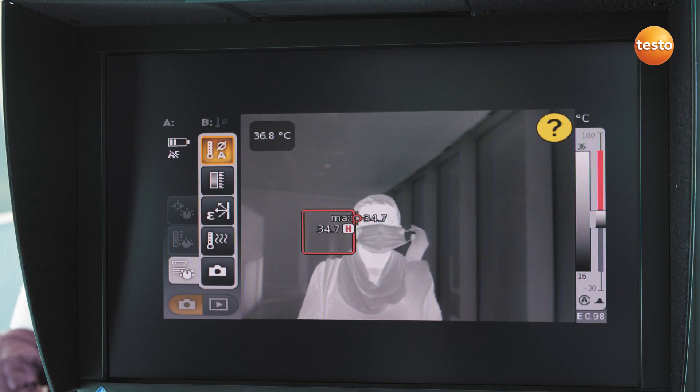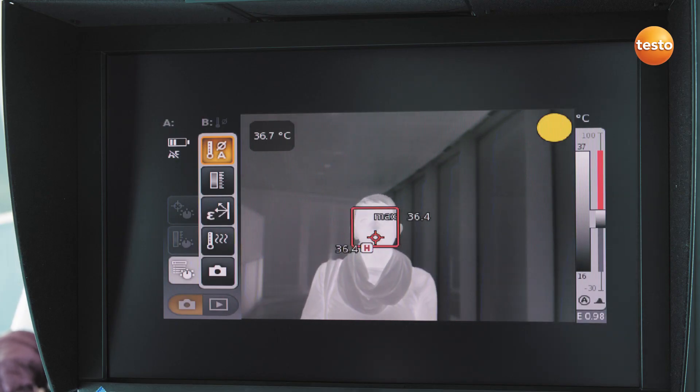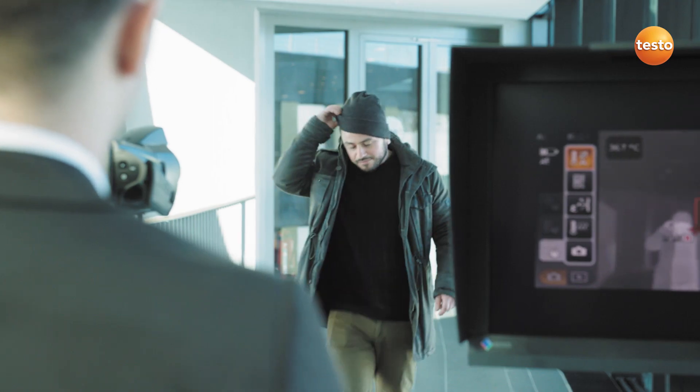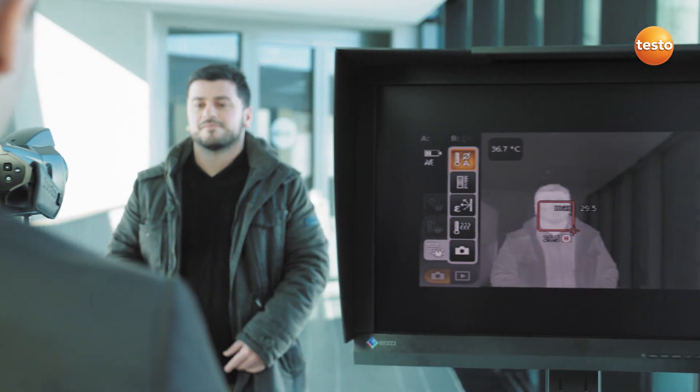Any surgical masks must also be removed, otherwise the thermal imager will not recognize the face. The same applies to head coverings — please remove these also.